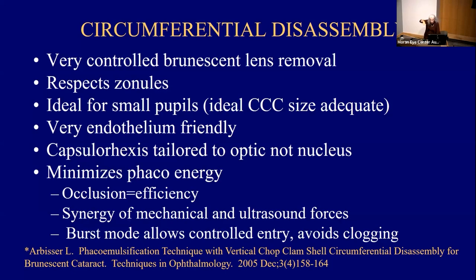At any rate, you're making a nice wide sculpt, but the last thing you want to do if you're going to chop, and this is a chopping procedure, is to make a wide opening, because your goal is to get in and hold on and then apply your mechanical forces.